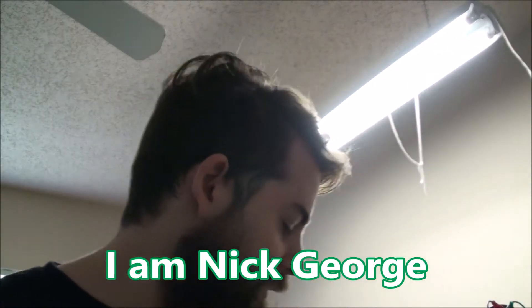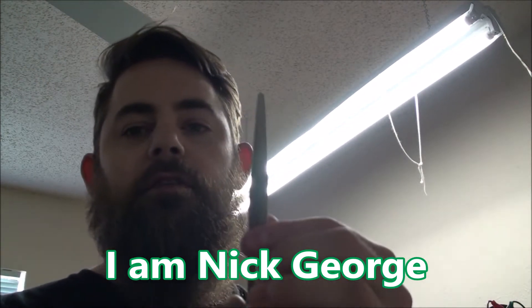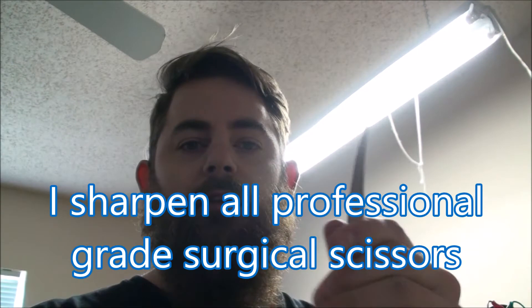Hi, this is Nick George with Clouds Diamond Sharpening, just to show you a demonstration on surgical scissors. Let's begin.